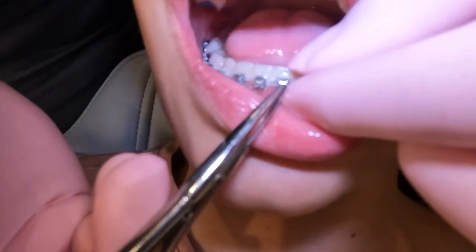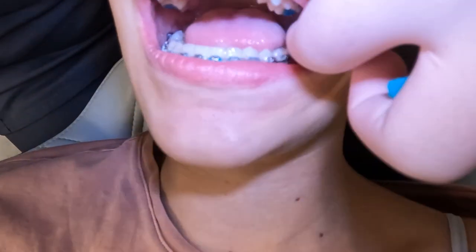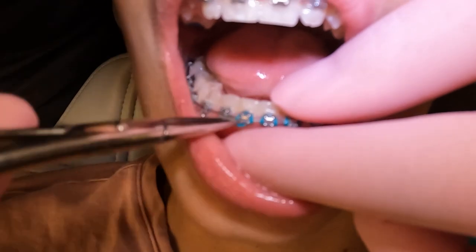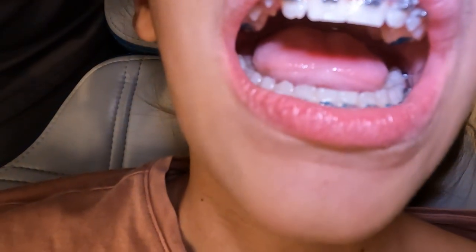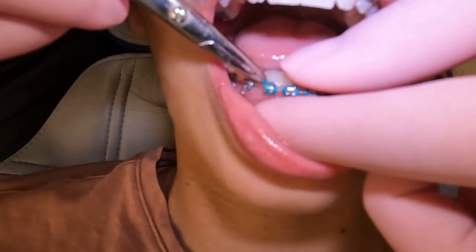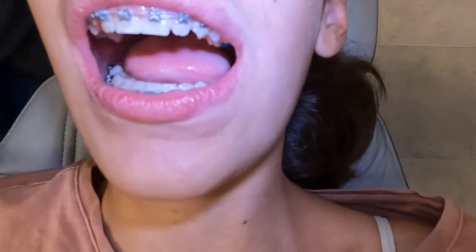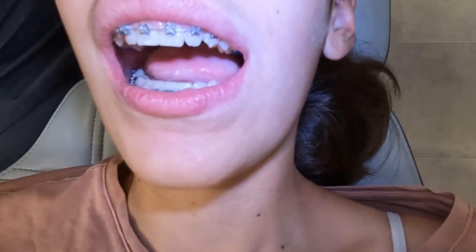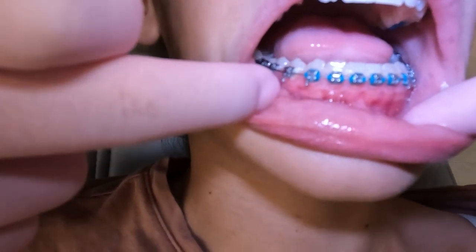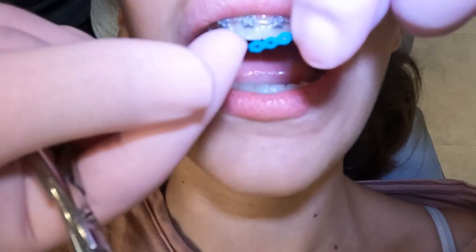Sometimes these colors will come off for whatever reason. If you have the special kind of bracket, it may not be absolutely critical that you get it back on. But if you have the old-school brackets where it doesn't have the clip, then if one of these comes off the wire could get loose, and you probably need to let your orthodontist know you need a quick fix. When we have these special brackets, we usually don't do colors all the way around — we just do the colors in the front where people can see.